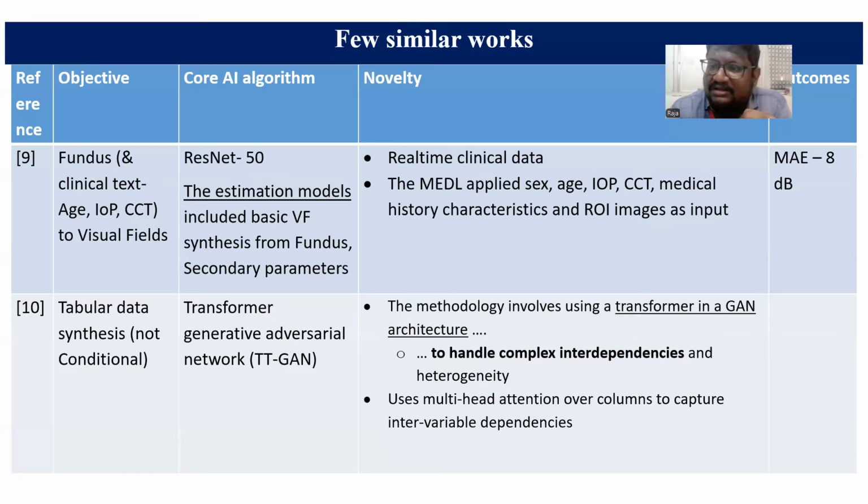And at last, during the testing phase, when we give the fundus image alone, the visual fields will be synthesized. So that is the thing I wanted to say. Whereas the second paper is to understand the very latest architectures being implemented in generative AI.